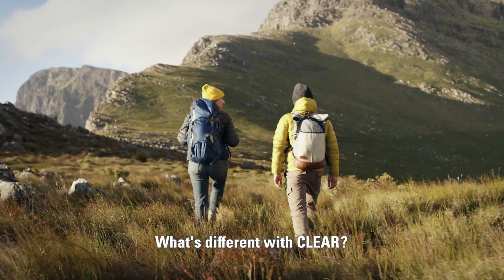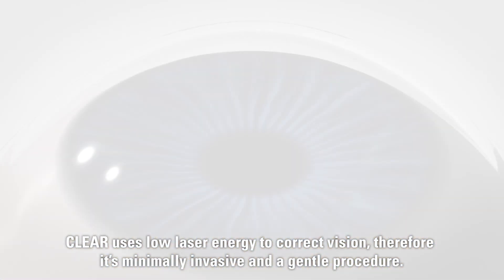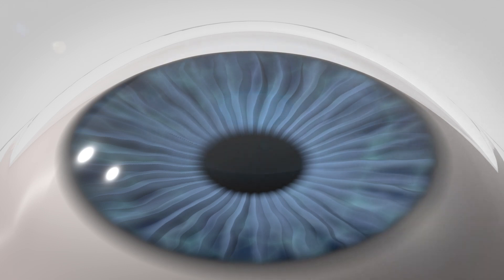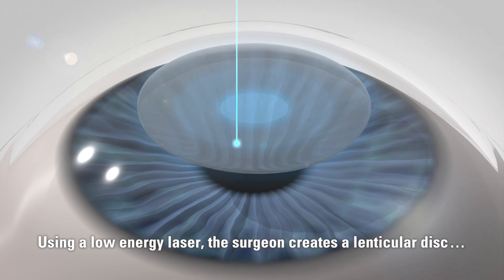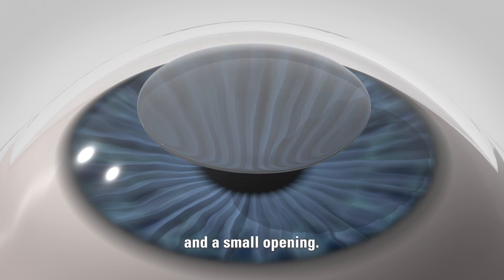What's different with Clear? Clear uses low laser energy to correct vision. Therefore, it's minimally invasive and a gentle procedure. Using a low-energy laser, the surgeon creates a lenticular disc and a small opening.